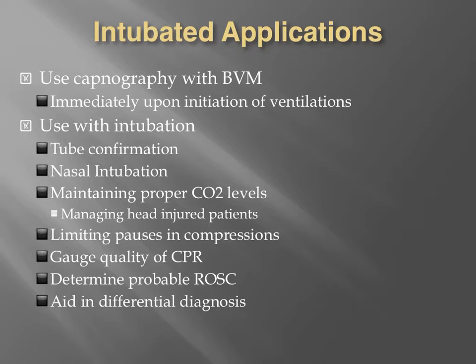So for intubated applications, we've discussed most of this today, and we'll cover the rest right now. We use capnography with our bag valve mask. I cannot stress that enough. If we're hooking up a bag valve mask, we should be hooking up our capnography to it. Or in some situations, we may use a non-invasive filter line on the patient first, and we may determine that they need to be bagged. We can just leave that cannula in place instead of switching out to the intubated version.